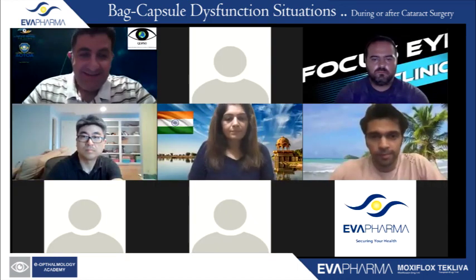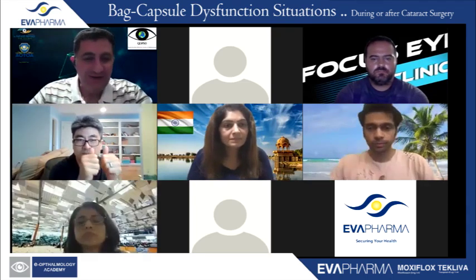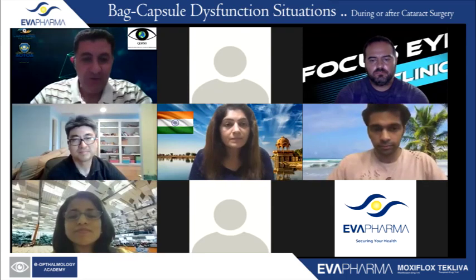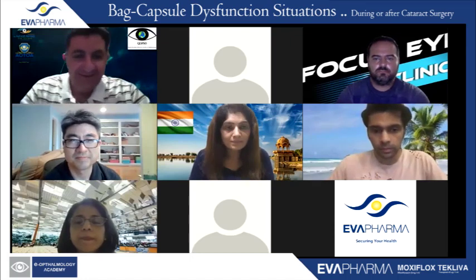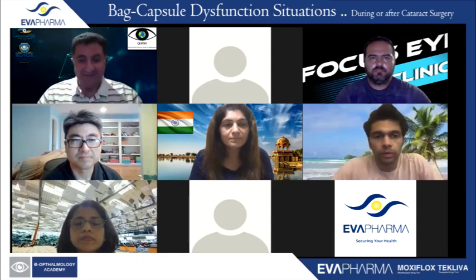Thank you, Priya. It's a very illustrative way for anyone to do a glued IOL. The first part of your presentation, for anyone who wants to start a glued IOL, is fantastic, really fantastic. Perfect. You have questions.